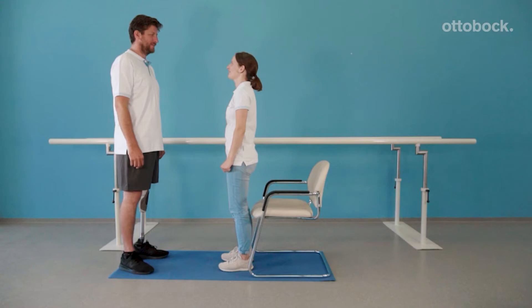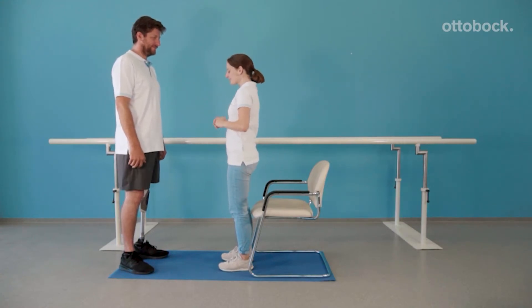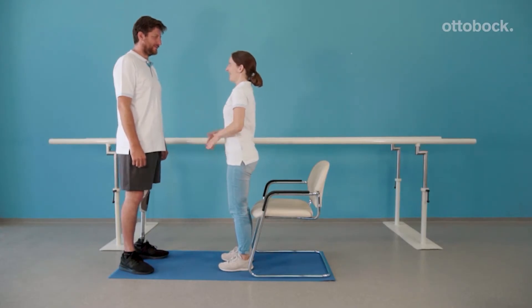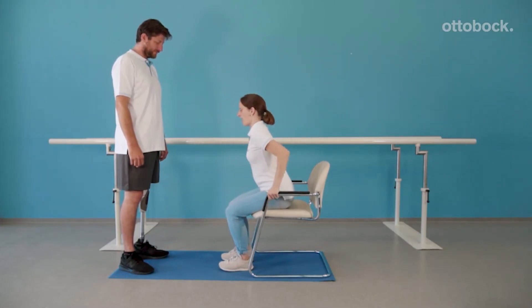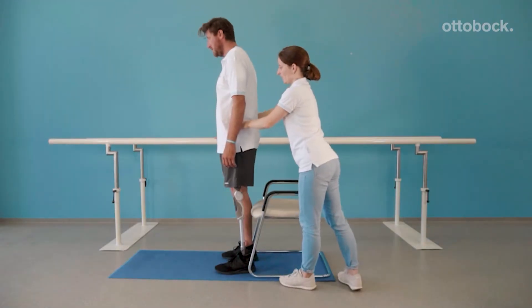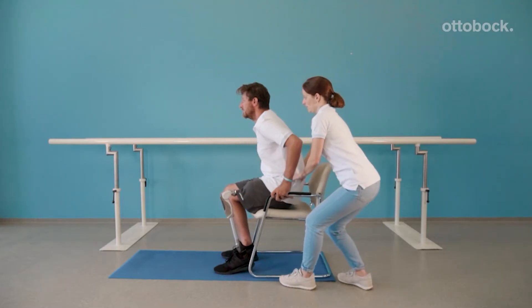Practicing sitting down helps to relearn loading both legs equally. Demonstrated here is how to distribute weight evenly on both legs and to keep the center of mass over the feet. Follow the principle 'nose to the toes.' Move the upper body forward, reach back with both hands, and sit down fluidly.